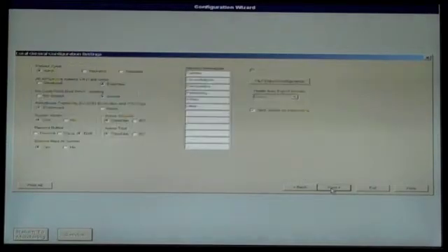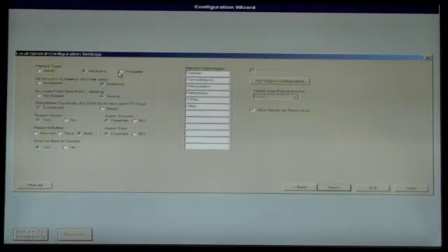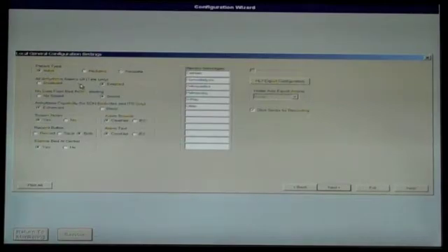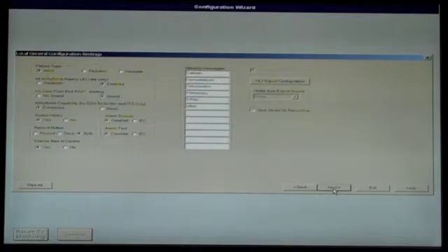On the Local General Configuration Settings screen, select your desired settings in the various options. Most users leave everything in default settings. Once all desired changes, if any, have been made, click Next.